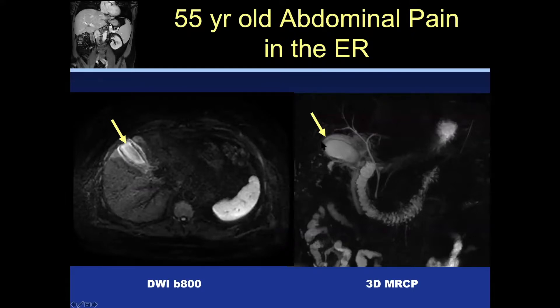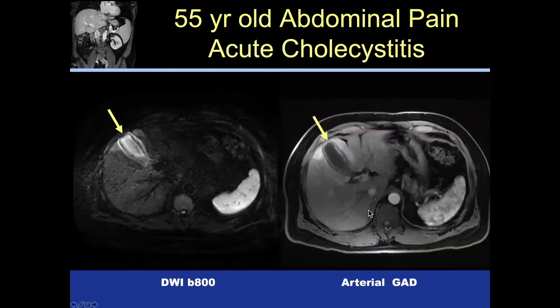MRCP was also performed, demonstrating abnormal pericholecystic fluid. The features of acute cholecystitis include restricted diffusion in the wall and surrounding pericholecystic tissues. On the arterial phase post-gadolinium, you want to see abnormal enhancement of the gallbladder wall as well as a halo of enhancement. You're not going to see every finding in all patients, but these are the findings which should convince you that you're looking at acute cholecystitis.